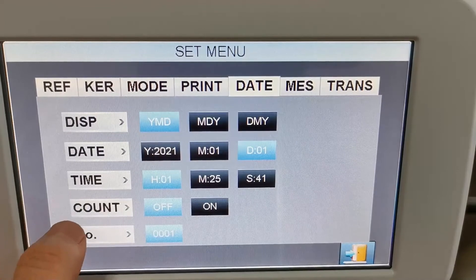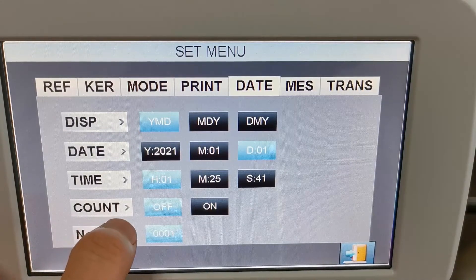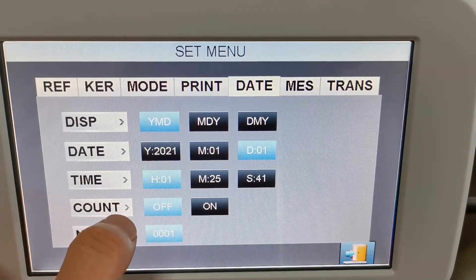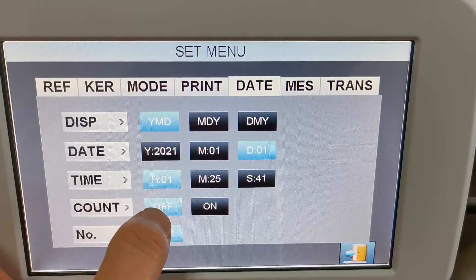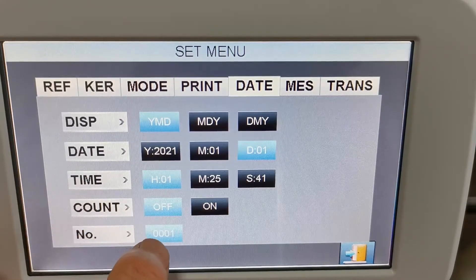Here is the count function — it will count the patients that have been measured. You can turn it on or off, and here is the starting number.